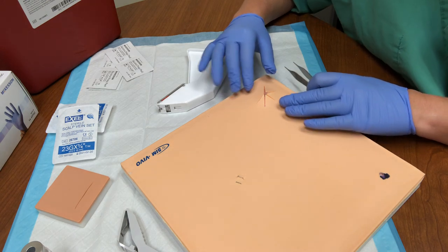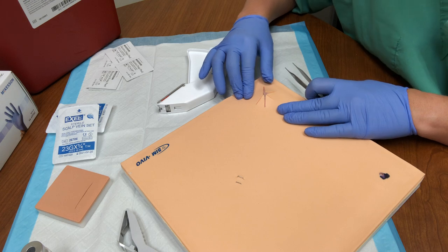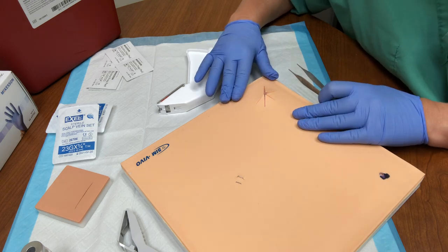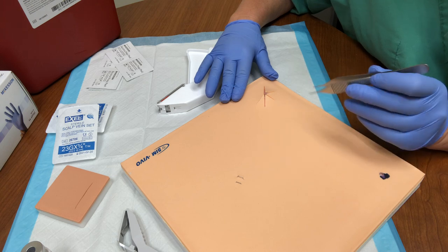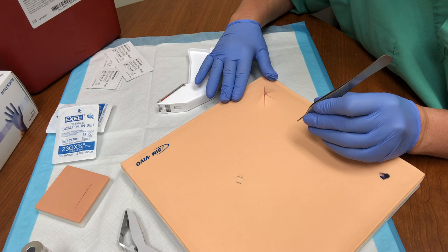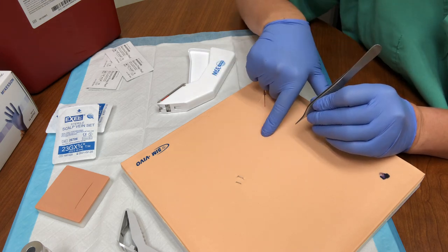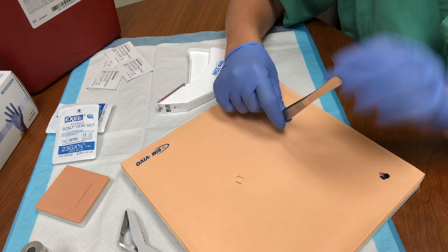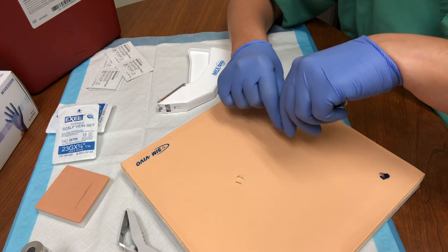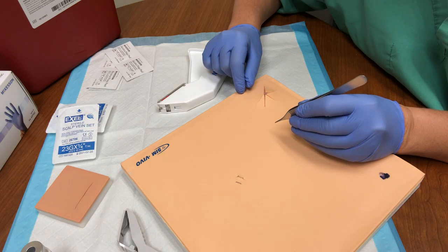Because of that, even though this looks pretty well approximated here on my fake person, it certainly in real life is not well approximated. You always want to hold your forceps as if you would be holding a pencil — that allows you a better line of sight to your wound. If I hold them the other way, I would not be able to see what's happening underneath me. So always hold those like a pencil.